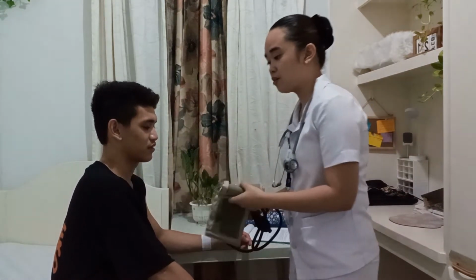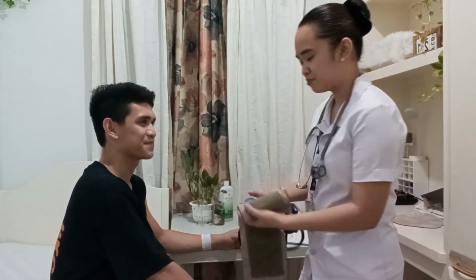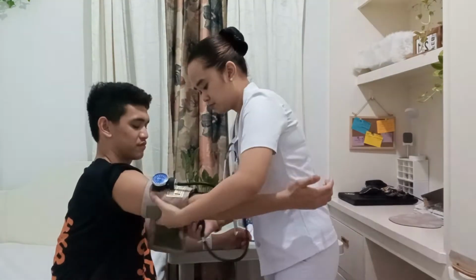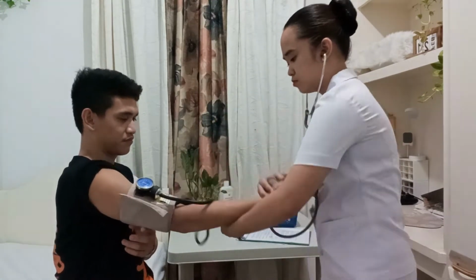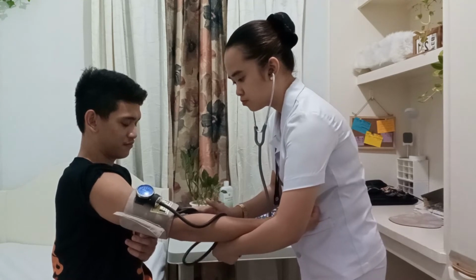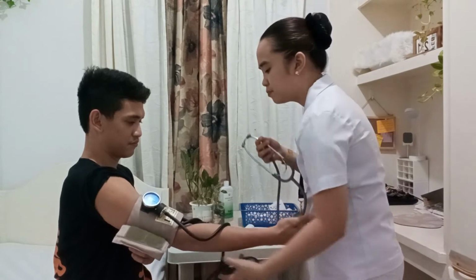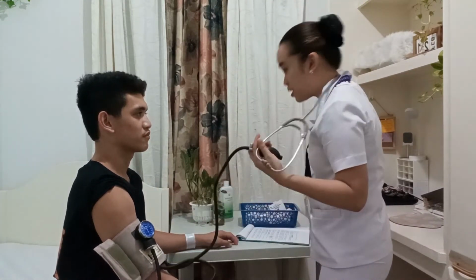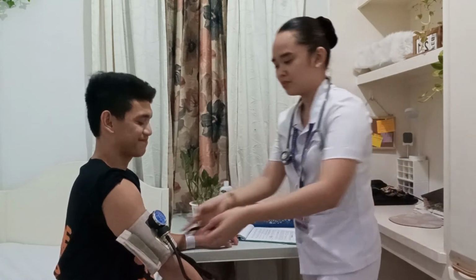Okay, Mr. Patrick, is it okay if I do the procedure on your other arm? Yes, of course. Okay, so your blood pressure is 115 over 75, which is a normal blood pressure. Okay.